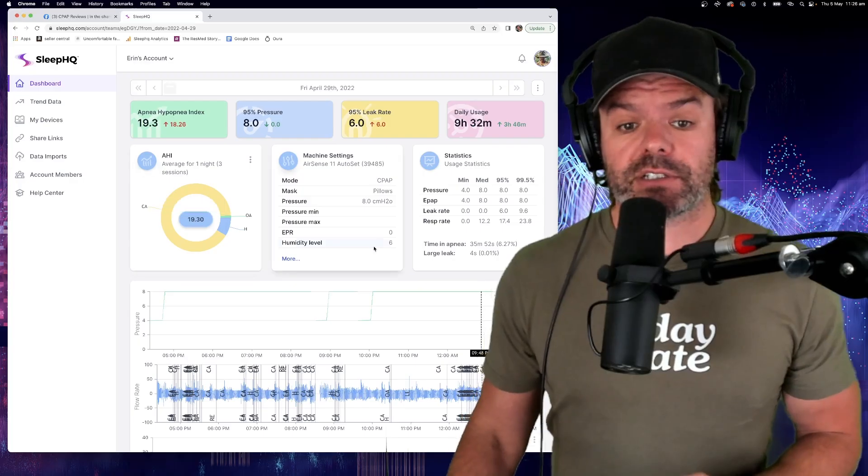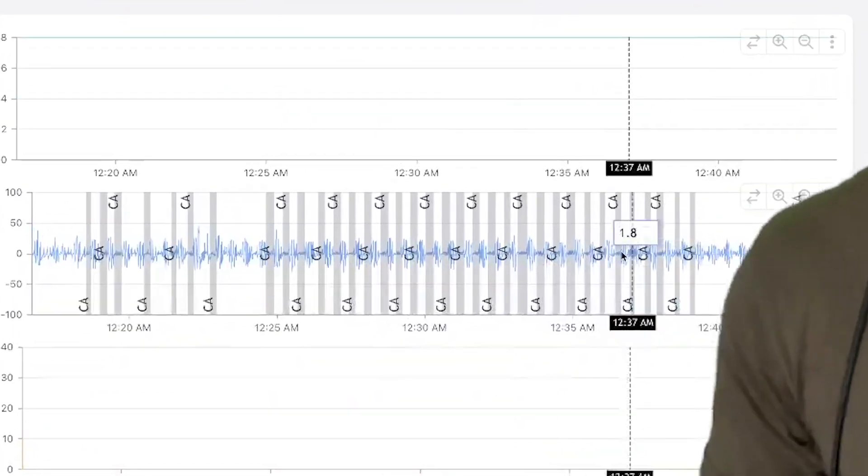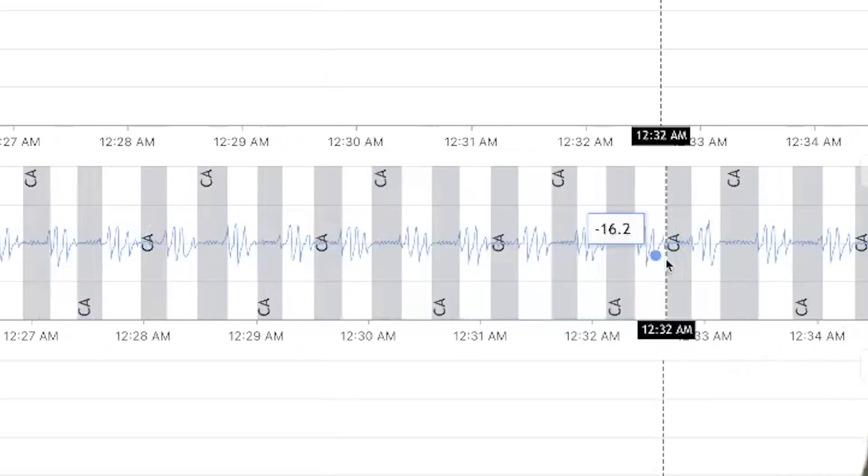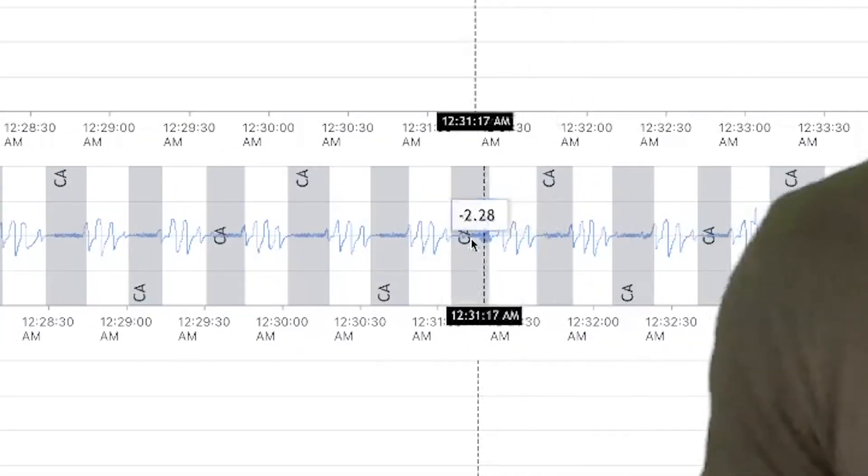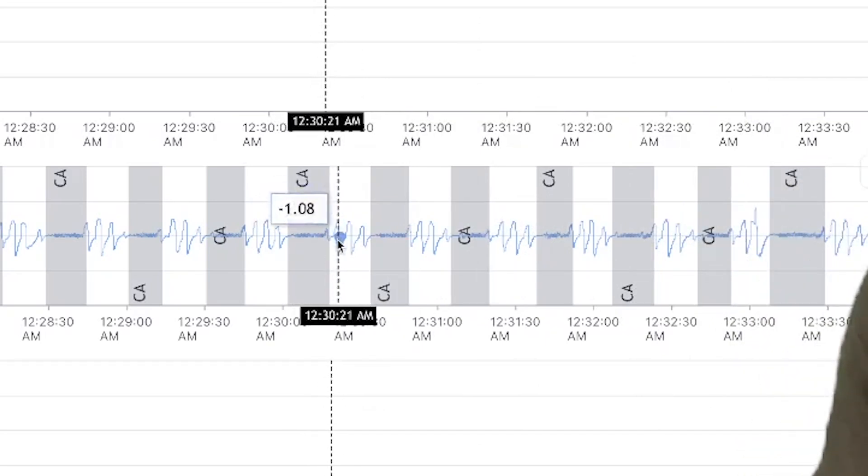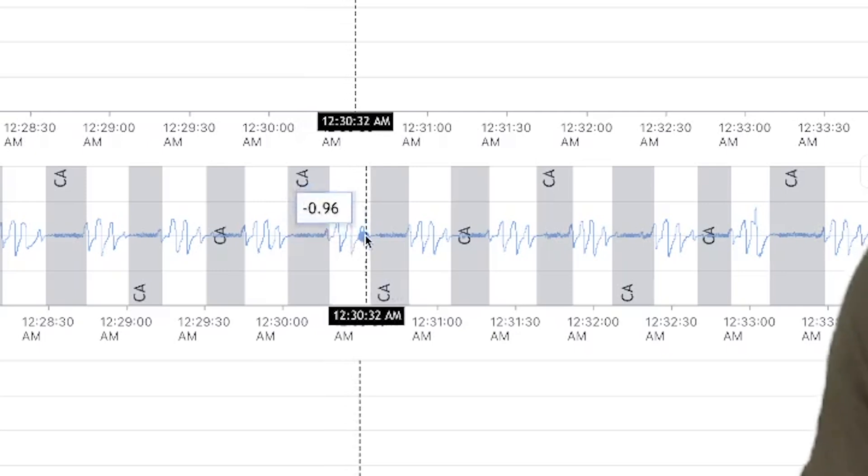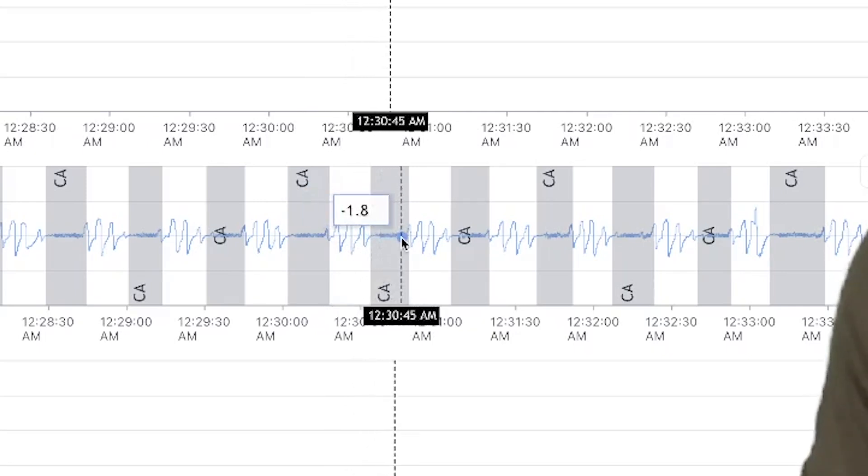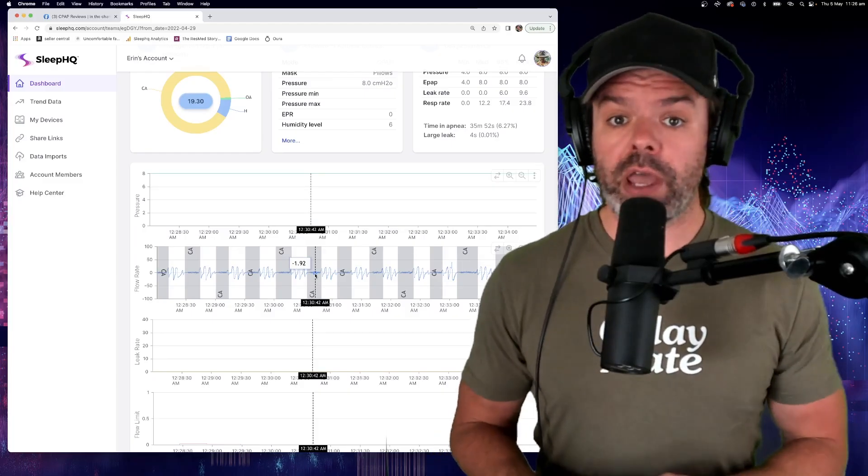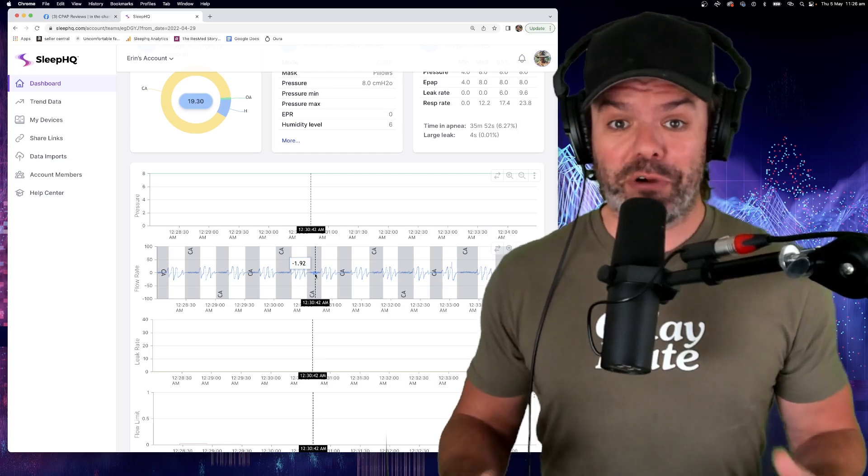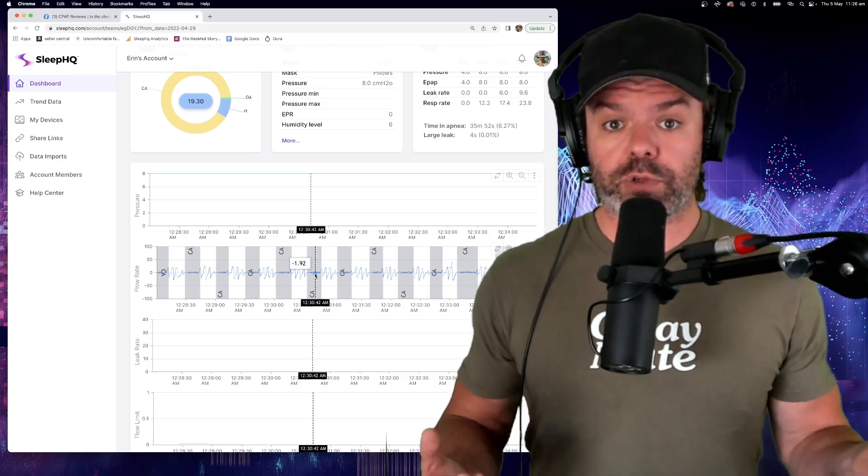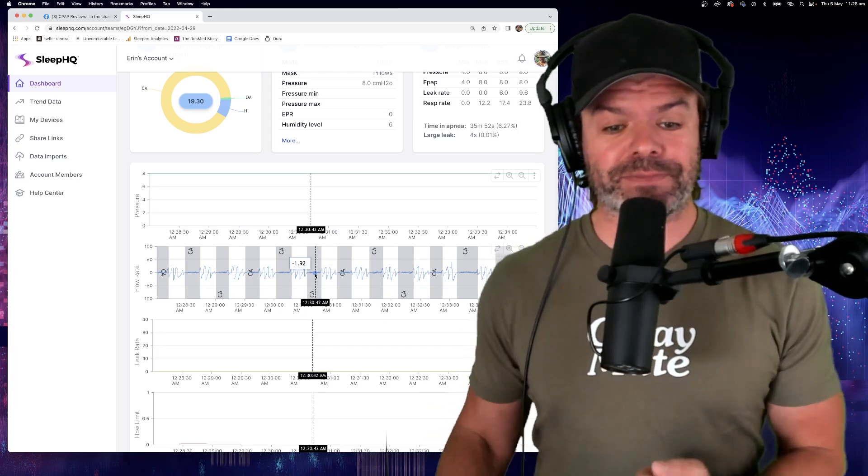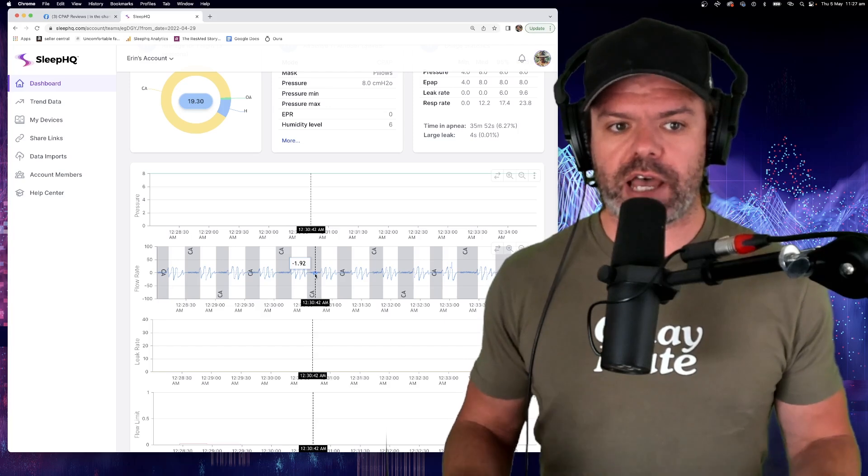Okay, so let's scroll down and have a look at what her breathing looks like. Let's zoom in and have a look at this. Can you see this? So this is Erin breathing here. Breathing in, breathing out, breathing in, breathing out, breathing in. And then she has these pauses. See the pause where there's just no flow coming in? This is a central apnea. Her airway is open. She's just not breathing. It's a bit of a signal fault going on between her brain and her lungs. So what on earth caused this to happen?